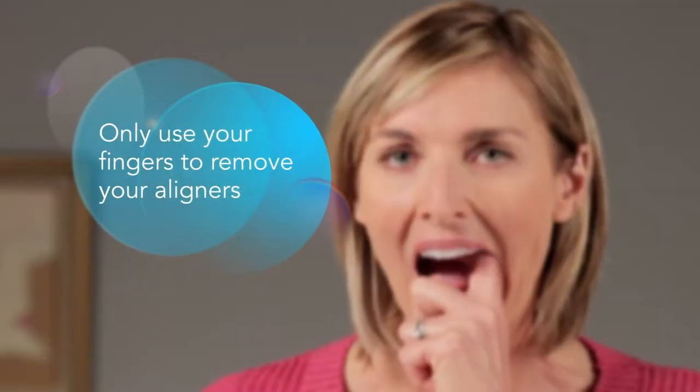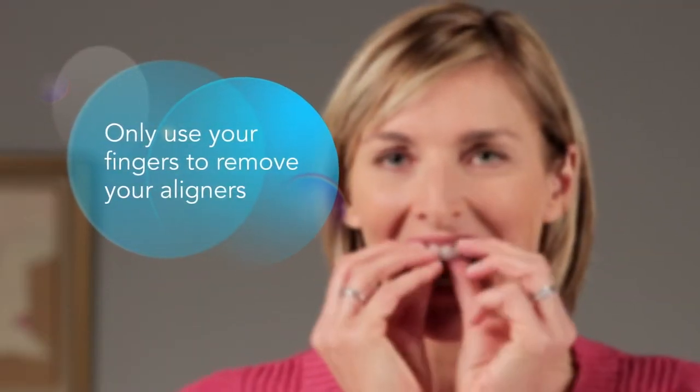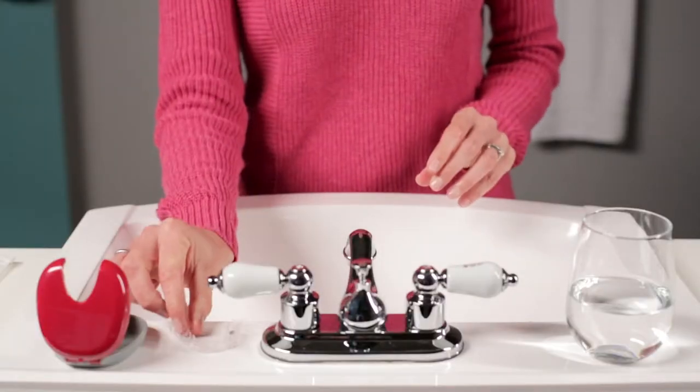Aligner removal is simple. Use your fingertip on the inside of your back molar to slowly pull the aligner from your teeth. Repeat on the other side, then remove the aligner.